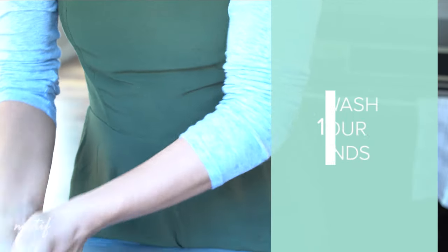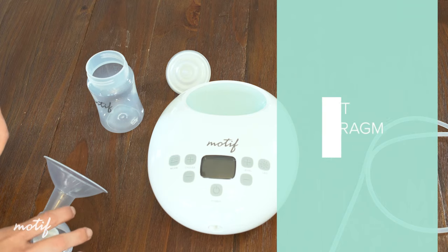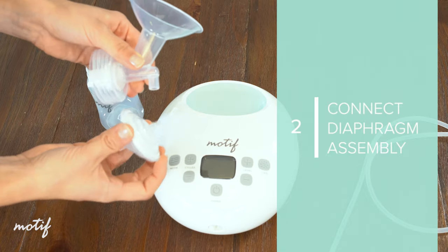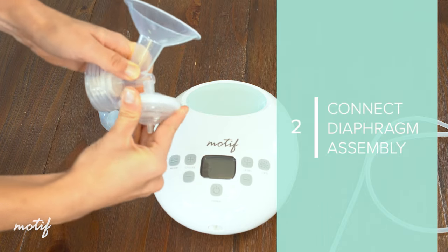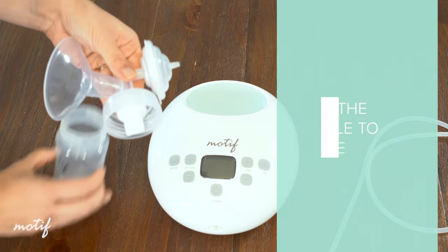Before assembling your pump parts, the first thing to do is wash your hands. Connect the diaphragm assembly to the top of the breast shield. Use a twisting motion to attach and later remove this assembly to avoid damaging it. Screw the bottle onto the underside of the breast shield.